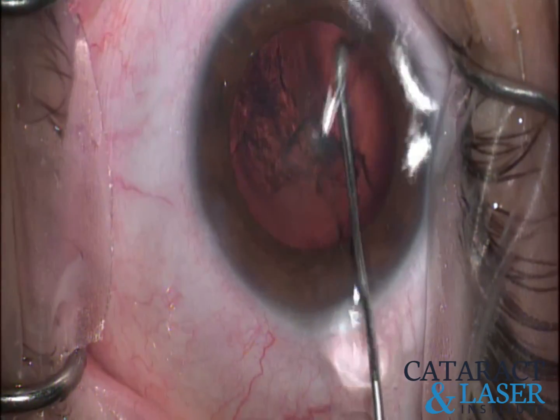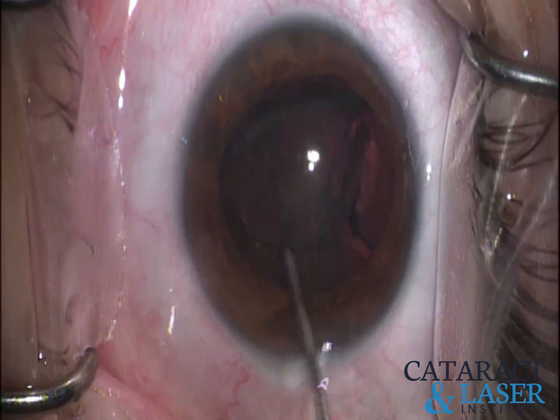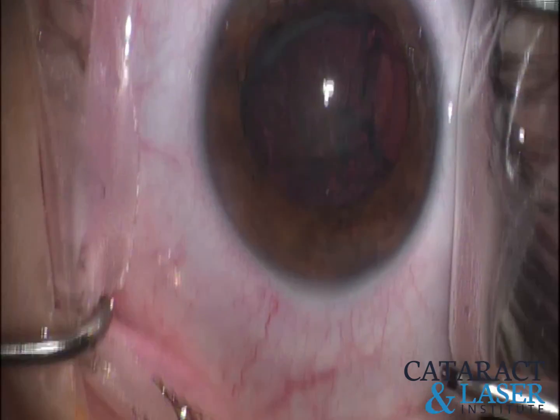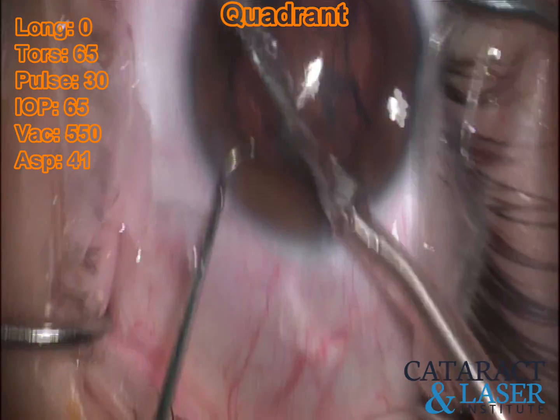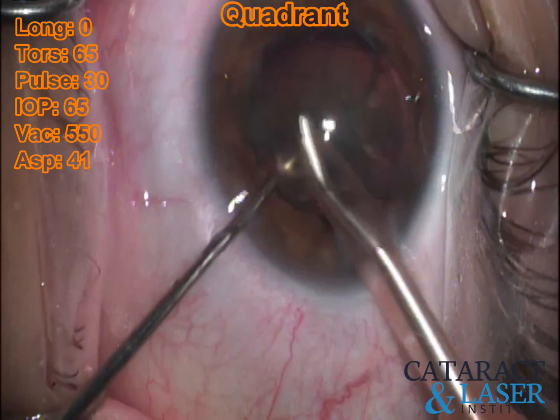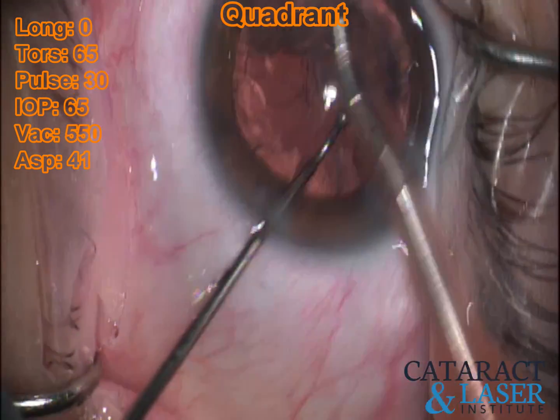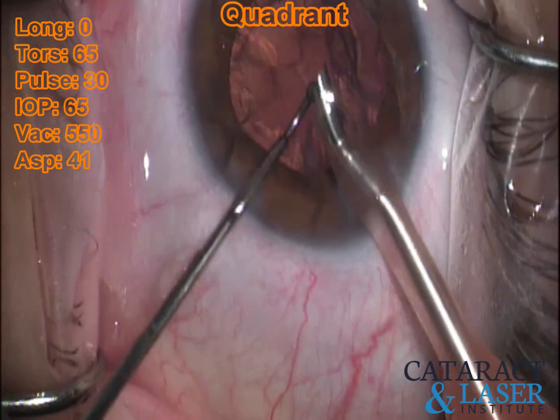I'm going into all four quadrants, doing a little hydrodissection — you can see that lens is popping into the anterior chamber. I'll give it a little push at the back to make sure it's poking up nicely. At this point I'm going to put my phaco straight onto the quadrant setting and use as little phaco energy as possible — really just using it to suck up the lens with intermittent bursts of energy. With that first movement it's flipped the entire lens into the anterior chamber. I keep my secondary instrument posterior the entire time so the capsule doesn't run up into the phaco tip. These soft lenses really just suck up nicely on the quadrant setting, using more vacuum than anything else — very, very little phaco energy at all.